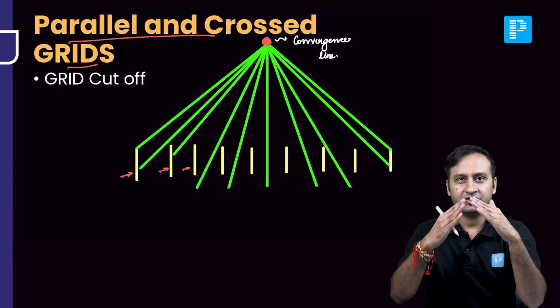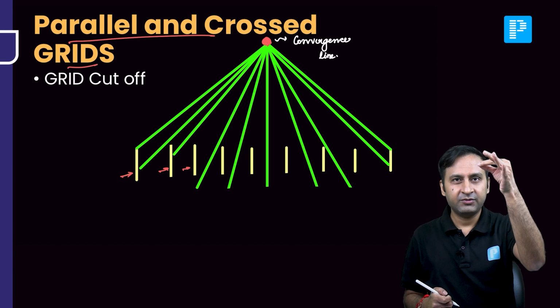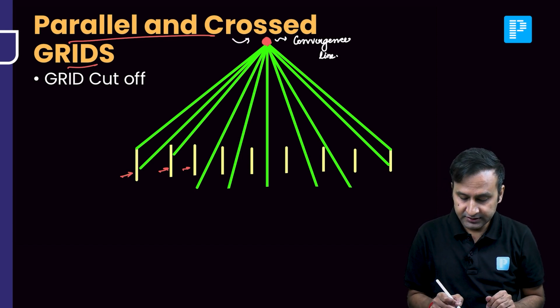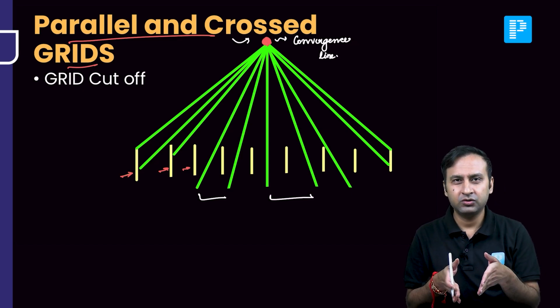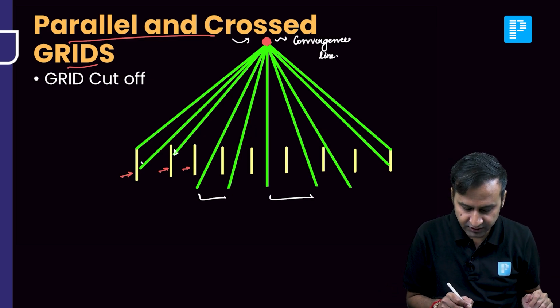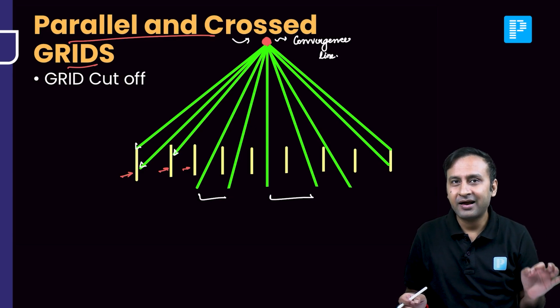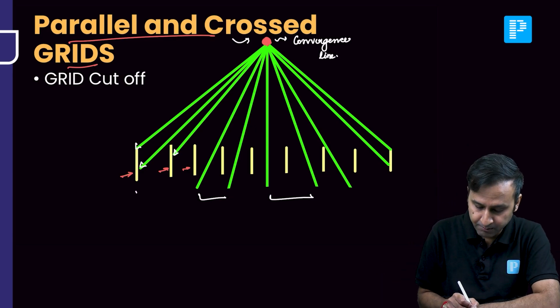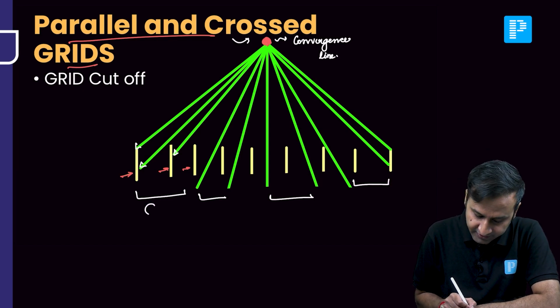We see here that the radiation is actually moving in a fan-shaped manner, extending from the central part, which is basically the source of the radiation. Now, the central radiation, as you can see, can pass through the grid because it's almost parallel to the lead strips. But when we go towards the periphery of the grid, this radiation becomes more oblique. As a result, even the parallel or primary radiation placed peripherally is going to be blocked by the grid.